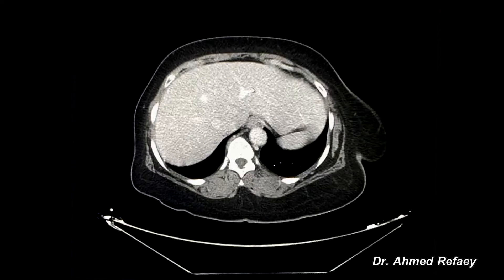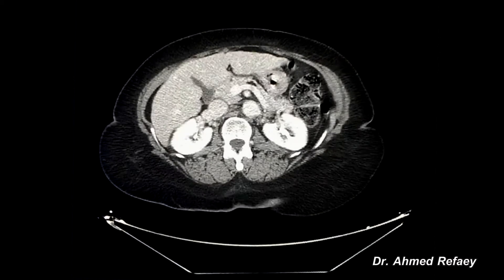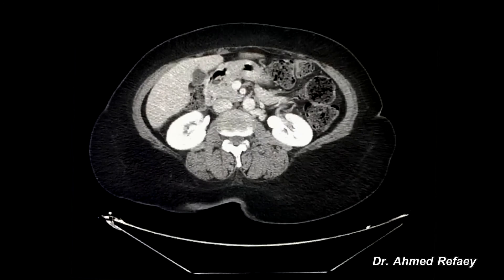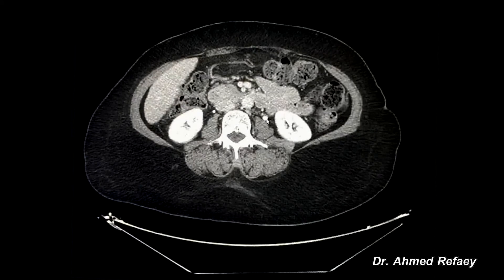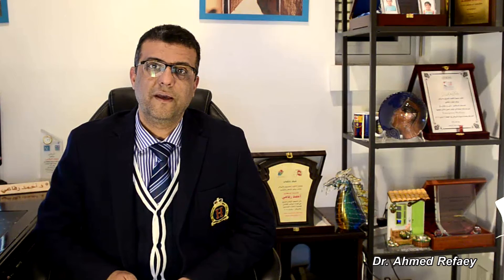Also in the delayed phase, which is very important, we can appreciate the washout of contrast from malignant tumors. In this phase you can also appreciate excretion of contrast from both kidneys — this is the right ureter and this is the left ureter — with contrast seen inside the ureters and in the pelvicalyceal system.